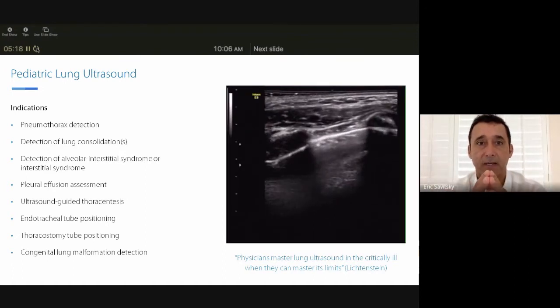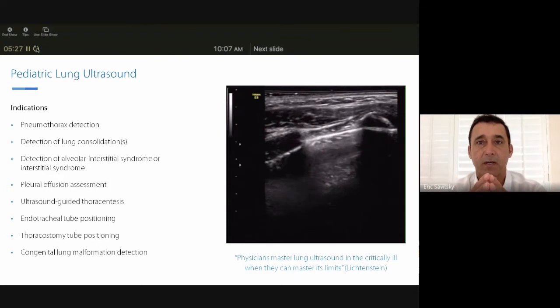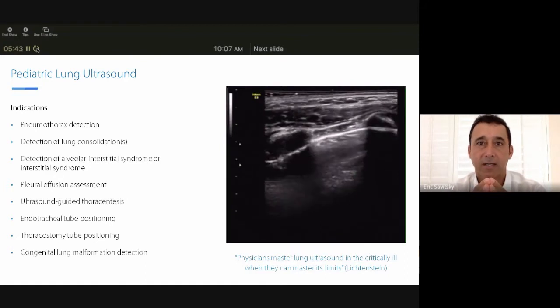clinical decision making. And whether you're a point of care user or sonographer, understanding the pleura and the lung is important, just because it's seen in so many of your image windows, whether you're doing echocardiography, if you're on echo track, or if you're just doing a general abdomen and looking at soft tissue or the thorax. It's really important to understand what the lung and underlying lung parenchyma and pleura look like. And for point of care users, the applications are super important.